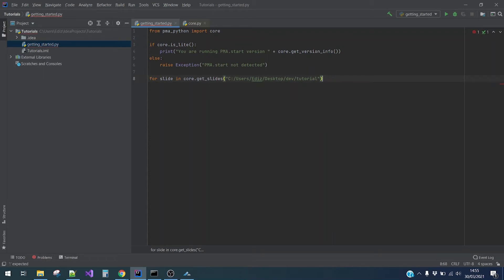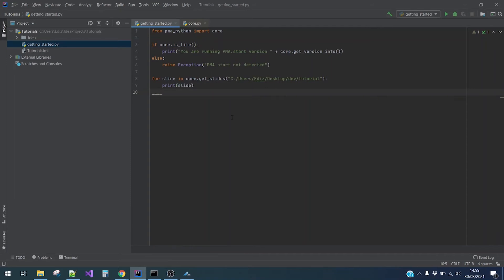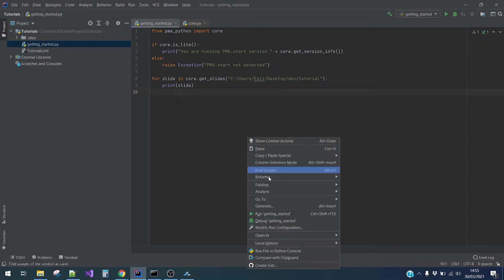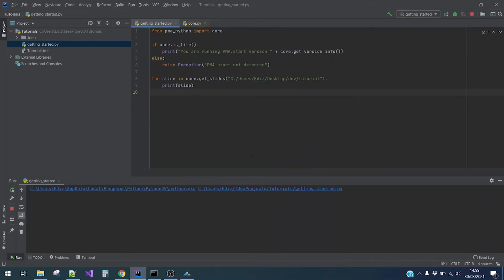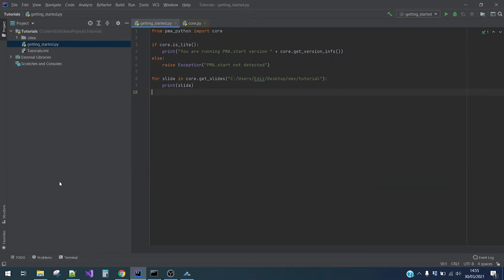And then we will print slides. All right, this works. As you can see, I have slide.mrxs in my tutorial folder.